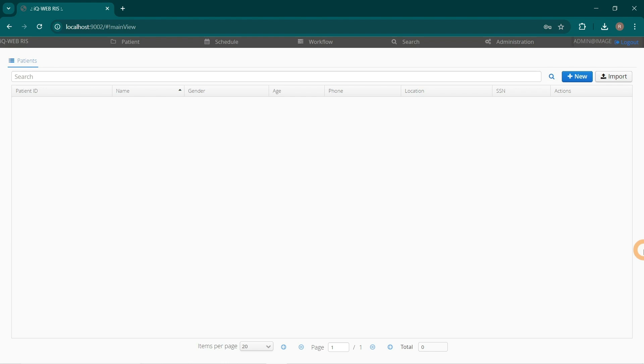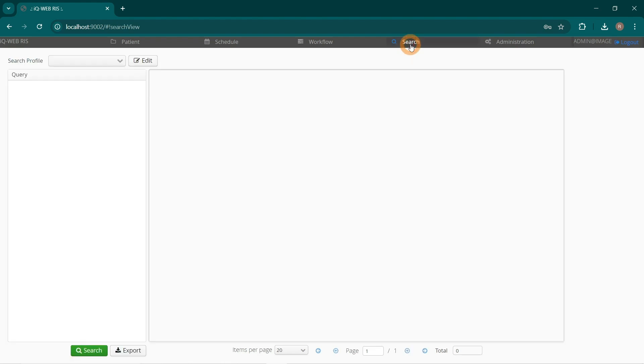For doing this task, I will go to Search tab. Choose Search Profile Search for Procedure.